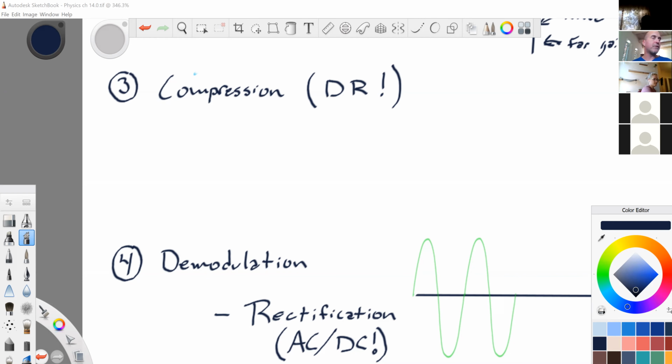Anyways, so you have all these shades of gray on our screen. Well, when you turn your dynamic range way up into the 200s on our decibel range, it gets to the point where the difference between echoes is so slight, there's such a slight shade of gray difference that we can't detect it.